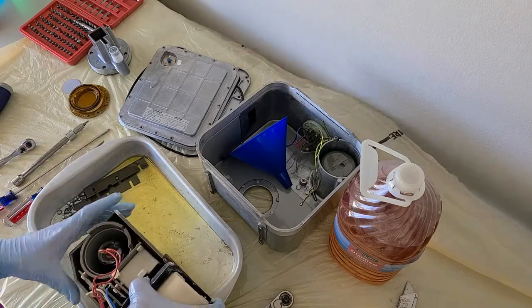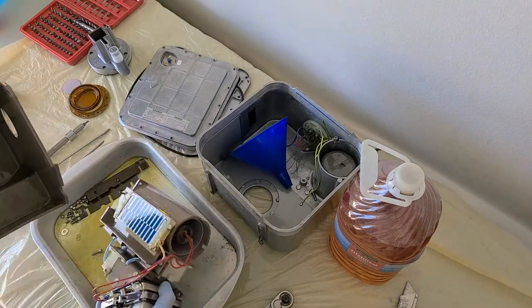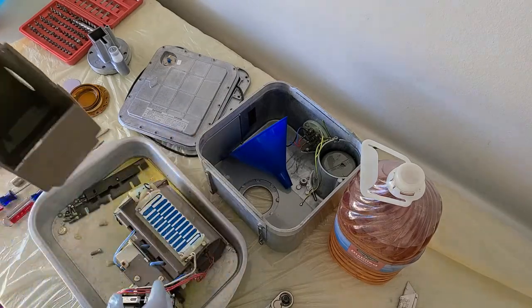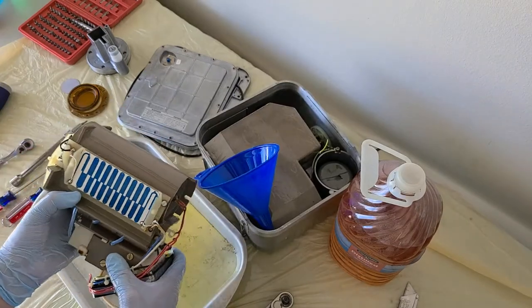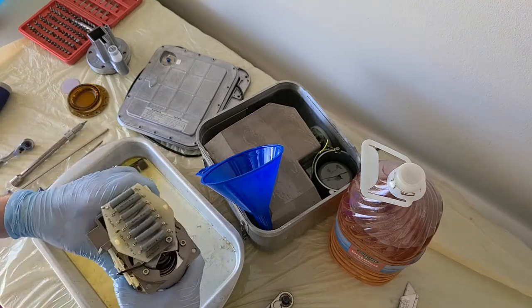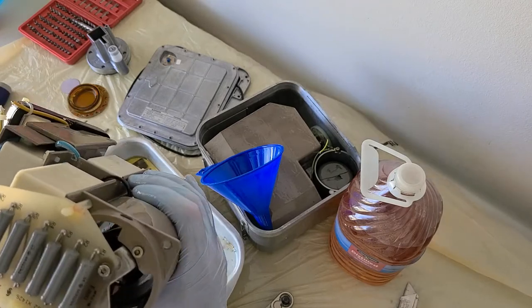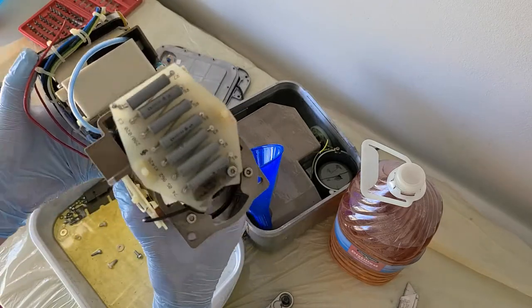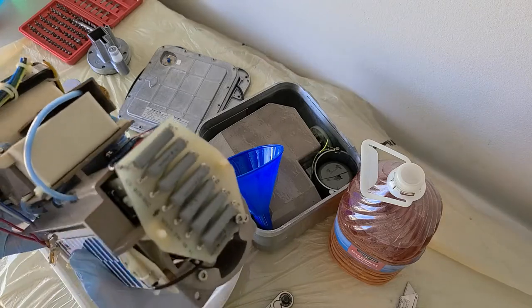All right, here we go, I got the sleeve separated. Here's that outer sleeve it was sitting in, let's just set that aside. All right, what we have here is the x-ray inner assembly. Looks like we have a bunch of resistors in series, it's pretty neat. I wonder what that's for, maybe to lower the current a little bit, who knows.